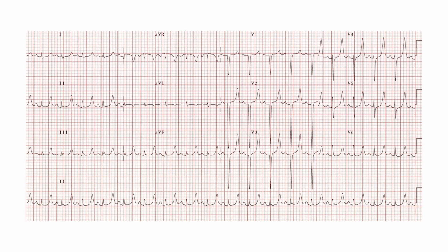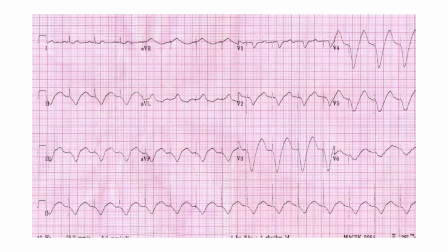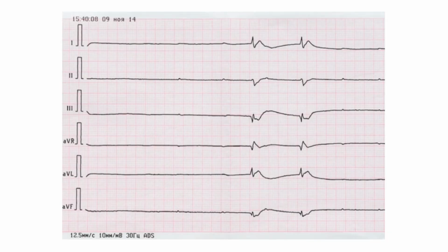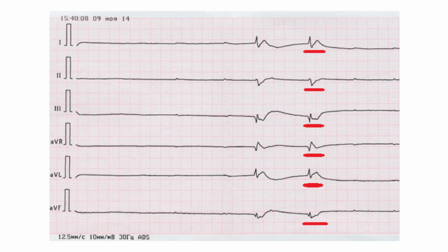So this is how hyperkalemia presents on an EKG: peaked T waves, then widening of the QRS. And this is when we start to see our ST segment elevation. Then we widen out even more until we get a sinusoidal wave. And then eventually we end up with asystole, which is bad. The little blips are just the heart saying, "Give me calcium, please."